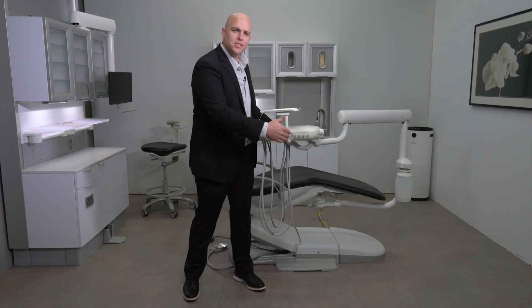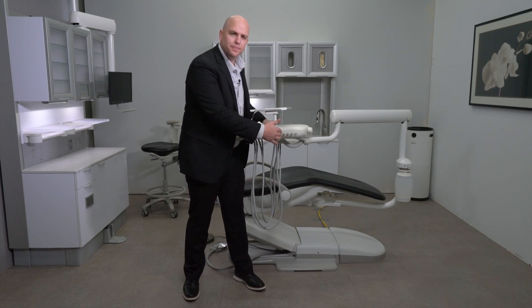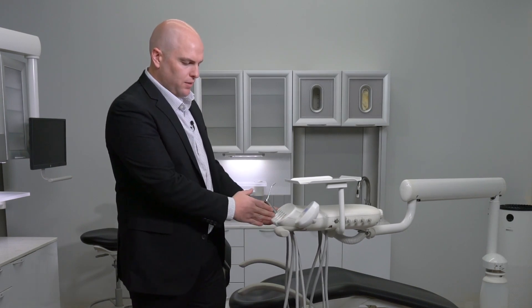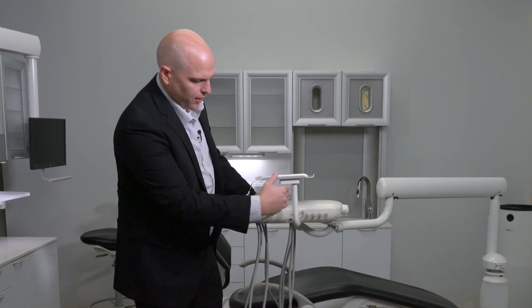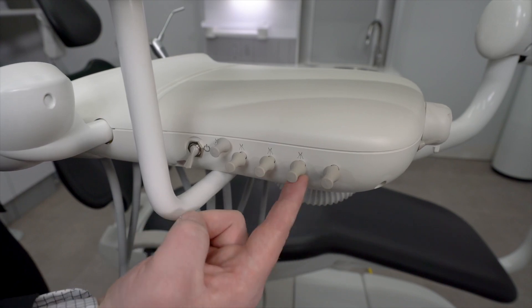As we continue to move down the side of the unit, the first knob we come to is your air adjustment, and then the other knobs are your water adjustments. The way these are numbered, you would start at the front of the unit. The first position is 1, 2, 3, 4, and they correspond with the knobs from front to back.